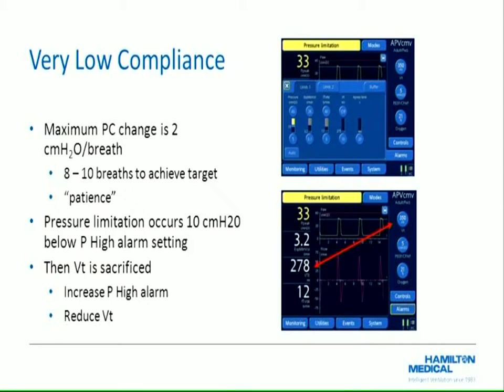especially in an intensive care unit and actually in the environment you're in, it's a complex environment. You got a lot of stuff going on. A monkey can turn the dial. It's knowing what to turn and when to turn it. That's the important part. You've got IVs, you've got communications, you've got God knows what other things you have to deal with on the aircraft or in the ambulance. And so really all you're relegating ASV to do is to turn a few of the more fundamental dials, primarily rate and tidal volume. You're still managing the patient. So you don't have to manage the ventilator. I think it would be best served if you spent your time managing the patient.